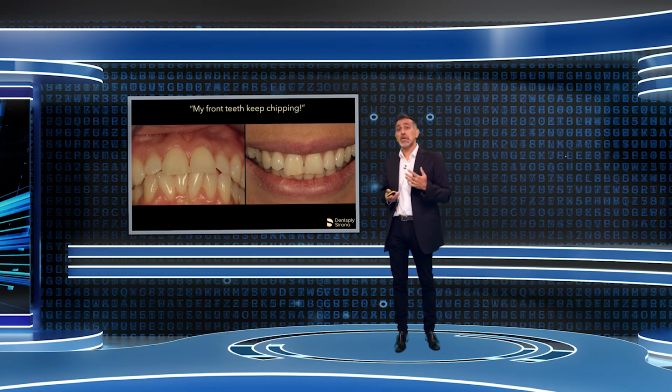So if a patient comes into you and starts saying my front teeth keep chipping, we've got to look further than just restorative treatment. This patient's front teeth kept chipping, and actually the reason why is she has a very slight mesiopalatal rotation on the upper centrals, and of course the lower crowding spilling forward is causing a constricted envelope between particularly the mesial point of the 2 upper central teeth. Along the canines and the premolars, there's good overjet, but on the central, there is a reducing overjet continually.